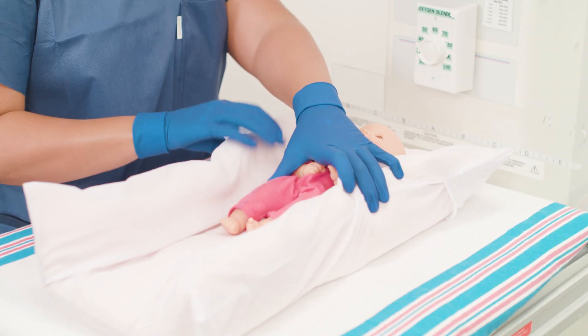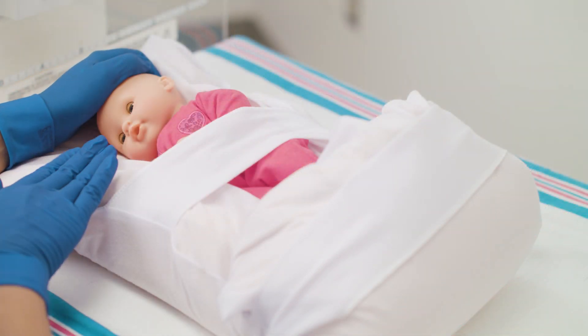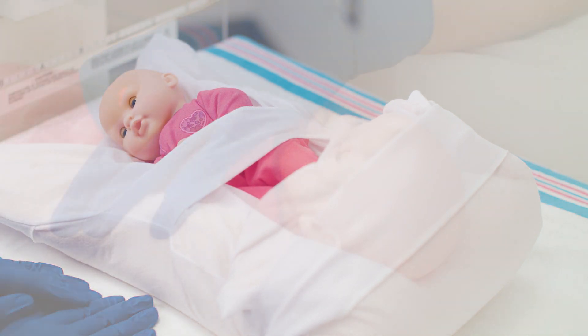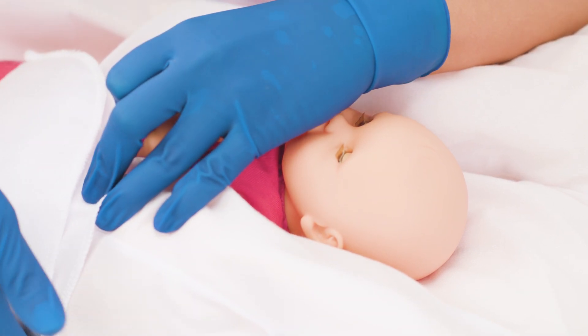The Molnica Z-Flow Fluidized Positioner facilitates developmental positioning for infants while helping reduction of pressure ulcers by offloading of bony prominences. This video demonstrates the use of the full body positioner to position a baby in supine, lateral, and prone positions.